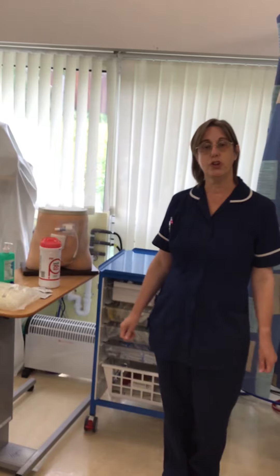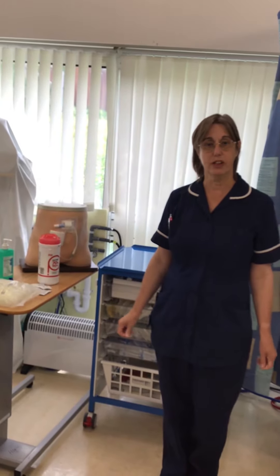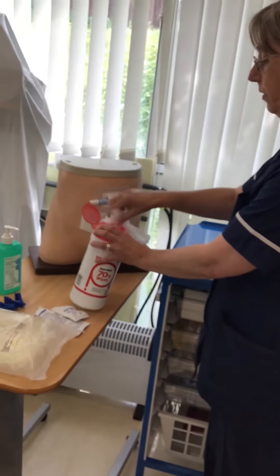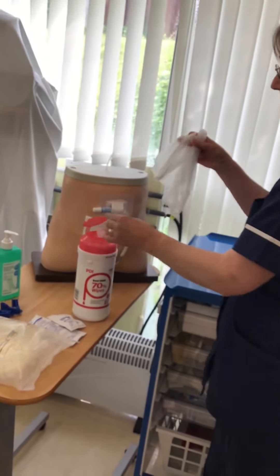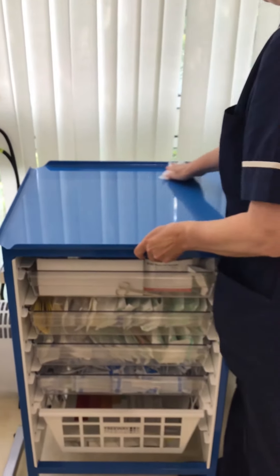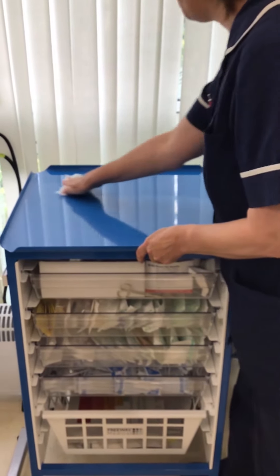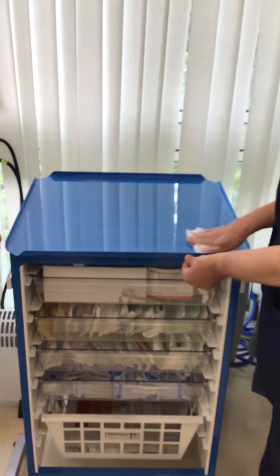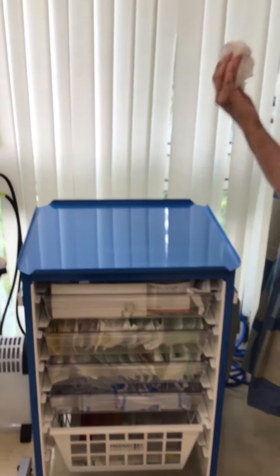Once you've washed your hands, you then need to clean your surface. With your alcohol wipes, take a handful, start from one side and go back, go across, come down and go back — so you're not cleaning across the area you've already cleaned. Then discard.